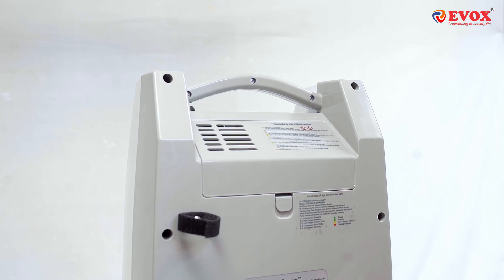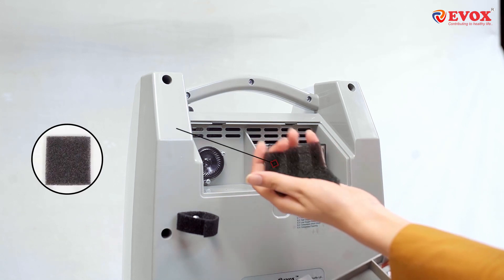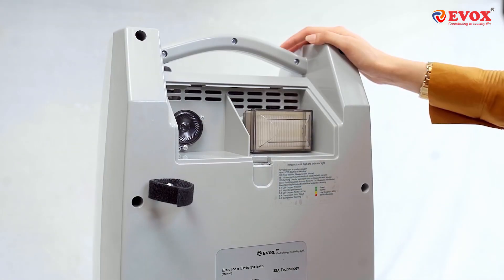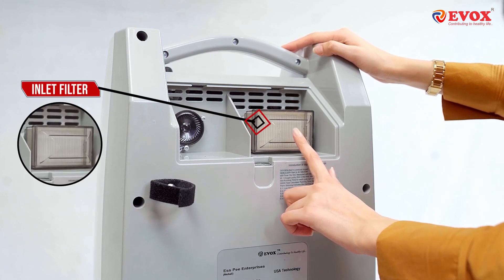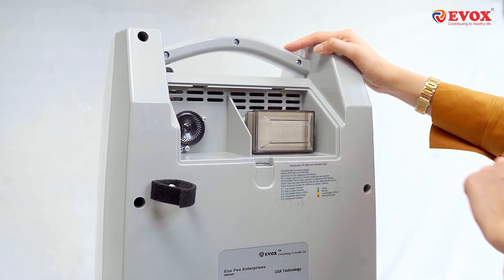Now I'll show you the outer filter. This has to be washed once every two to three days. On the other end, we have the inlet filter. Once the color of the filter changes from white to dark brown or black, it's your cue to replace it.